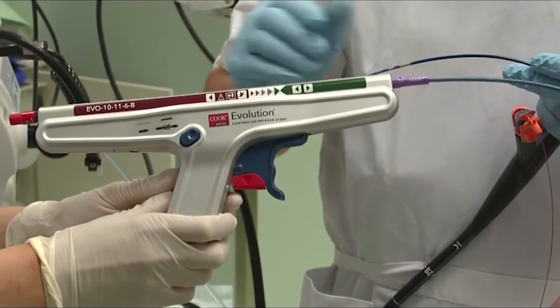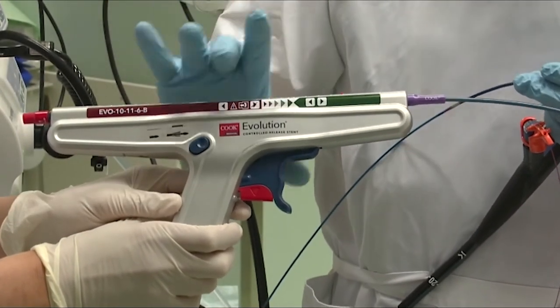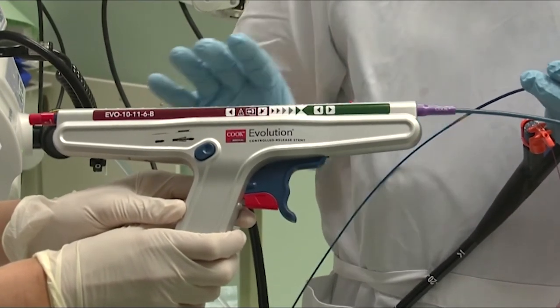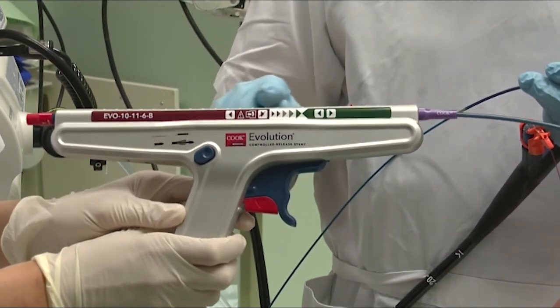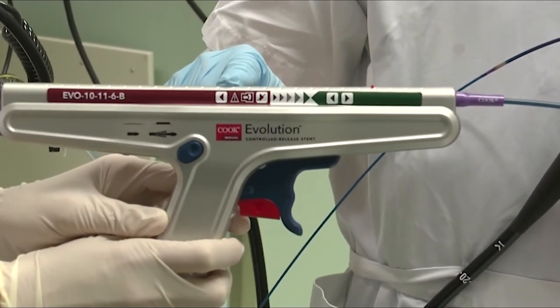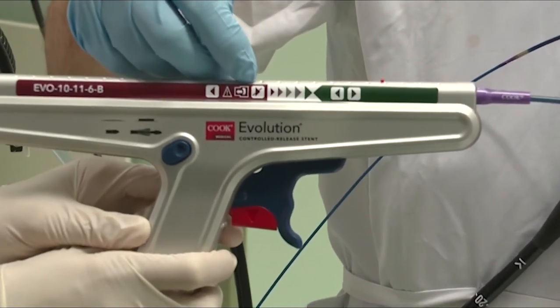A very nice feature of this new stent is the one-on-one relation between the deployment with this trigger and the deployment of the stent at the distal tip. Very controlled. We can see the movement of the deployment on this device. There is a point of no return, both a radio-opaque marker that we can of course see on fluoroscopy, but also a point of no return indicated on the handle.